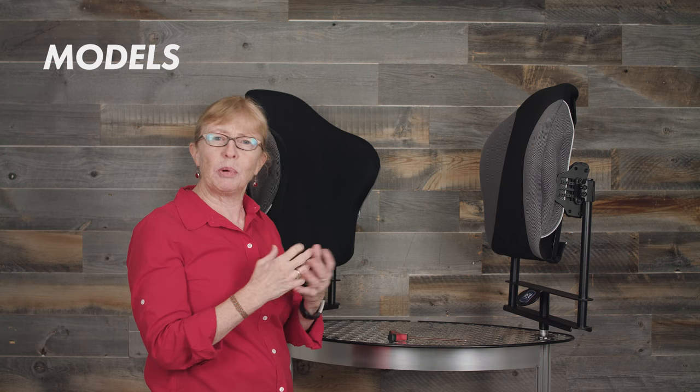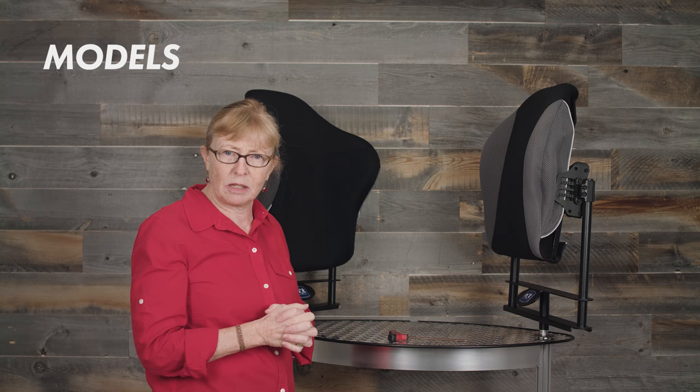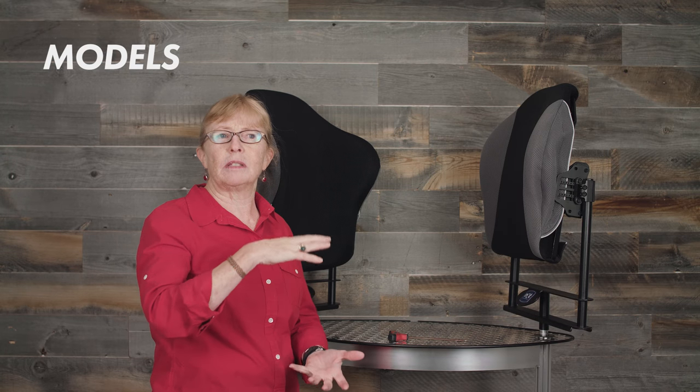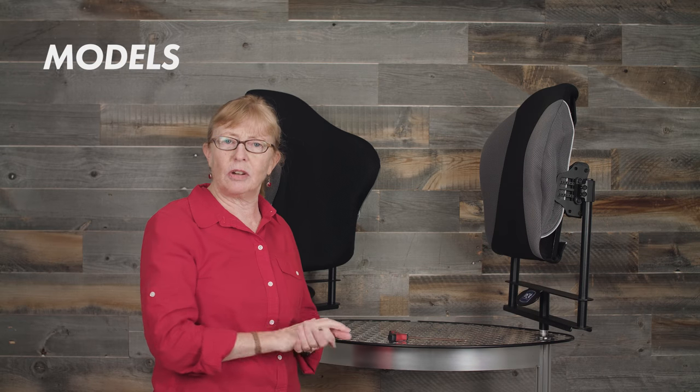However, one of my pet peeves has been that sometimes people feel they need a tall back just because the client is tall. So important measurements to take prior to ordering a back support would be from the bum to the PSIS, as well as from the PSIS to the inferior angle of the scapula. Over the years when I've measured people, regardless of their height, those measurements are not that different. Ultimately, measuring somebody helps you determine the back support length that you need.